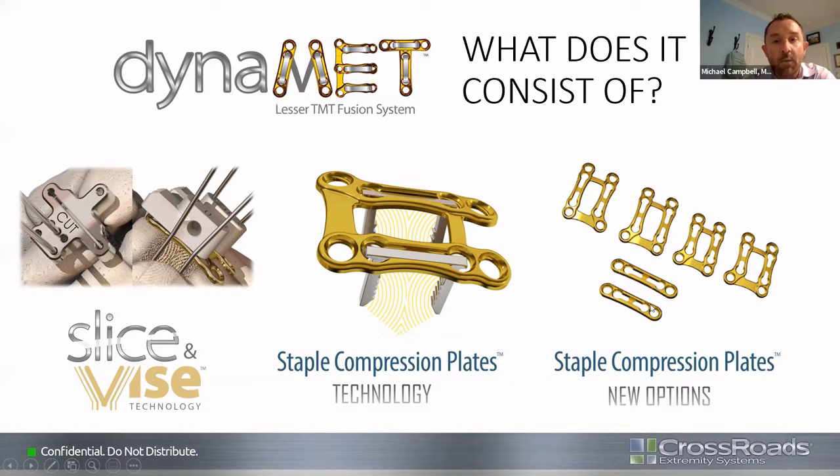The staple compression plates to work in the midfoot need to be shrunk. They've come up with a couple different options, and we'll talk about that in a few slides here.